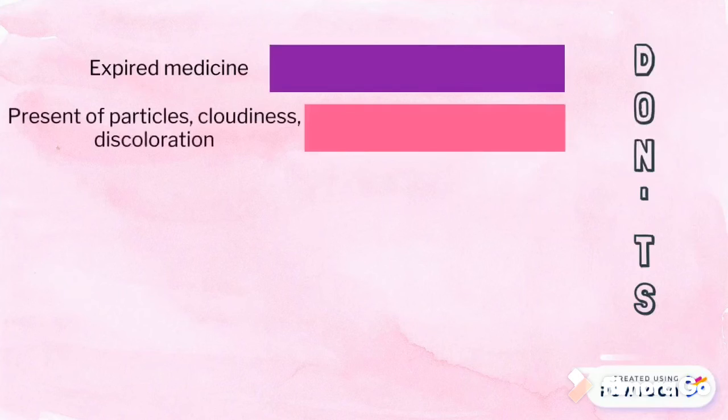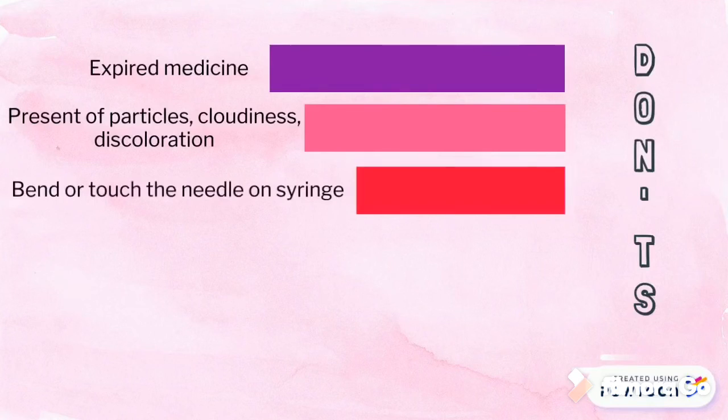Don'ts. Do not use expired medicine. Do not use the medicine if there are particles, cloudiness, or discoloration. Do not bend or touch the needle on the syringe.